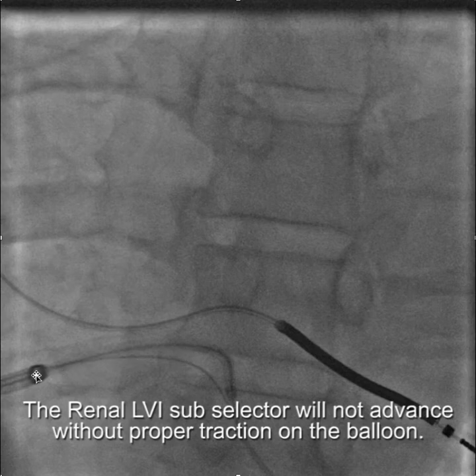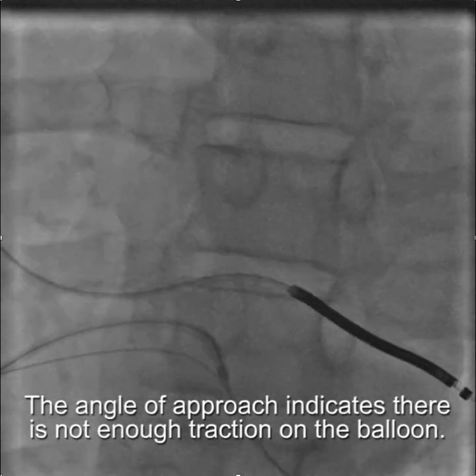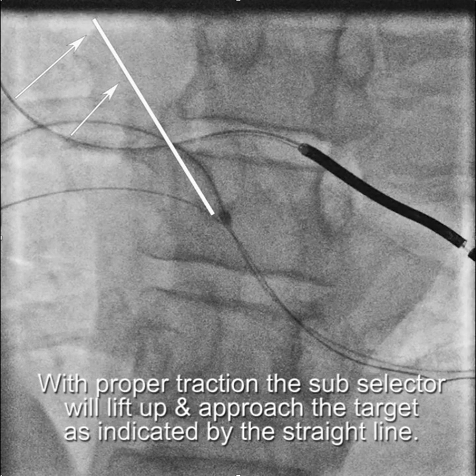You see how the approach of the subselector is very flat here, which means that we don't have enough traction on the balloon just yet. So the angle of approach indicates that there's not enough traction on the balloon. So with proper traction, this subselector would be lifted up like this. It'd be putting traction on the balloon, which would change the angle of approach so that the subselector would approach the target vein more directly.